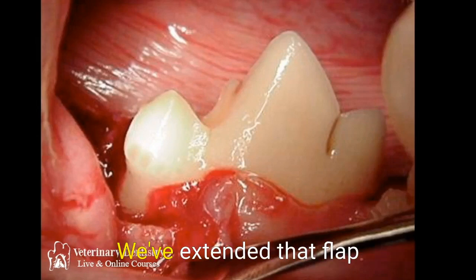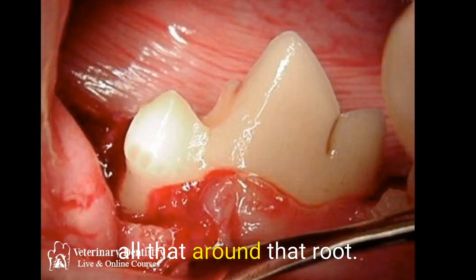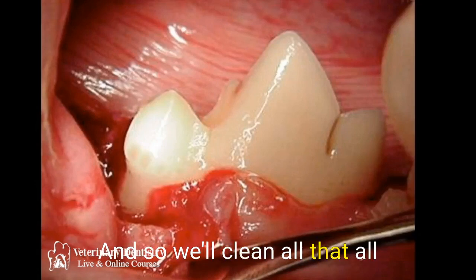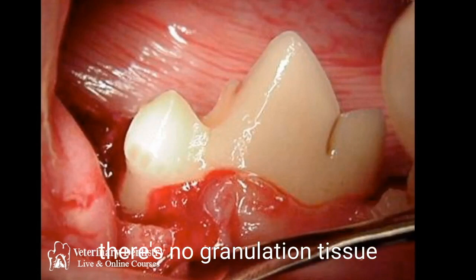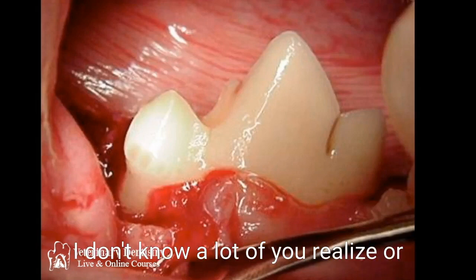We've just extracted that tooth and extended the flap rostrally so that we can expose all that area around that root. We'll clean all the way around, making sure there's no granulation tissue down in there using our curettes.